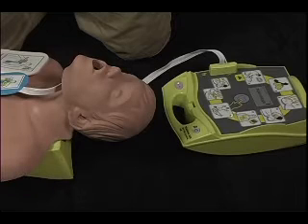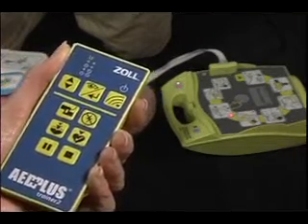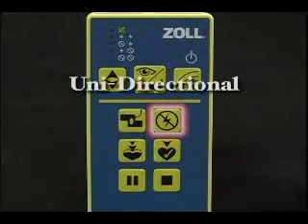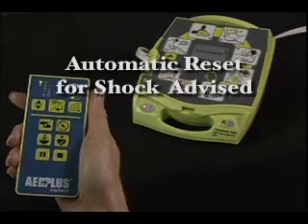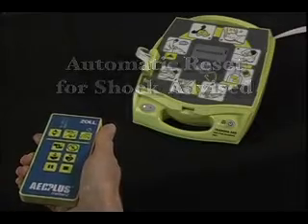Push the No Shock button once to force the next heart analysis to advise no shock. This button is unidirectional. Once you have called for no shock, you cannot override it to make the Trainer2 unit call for a shock. Once a heart analysis is over, however, the Trainer2 unit will automatically reset the next heart analysis to advise a shock.